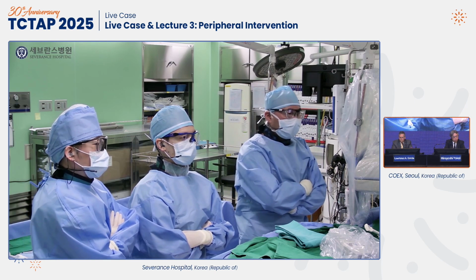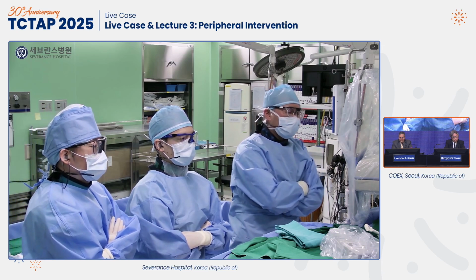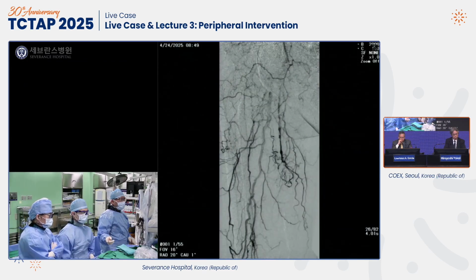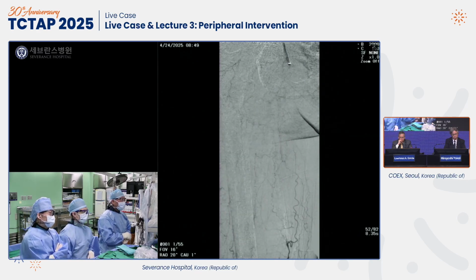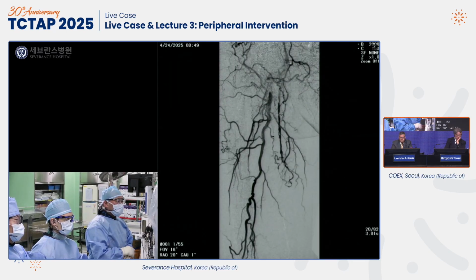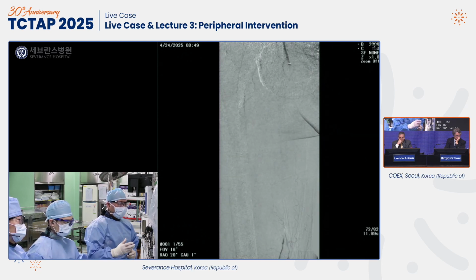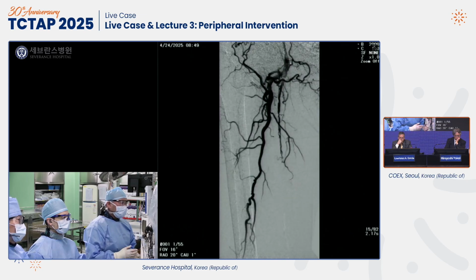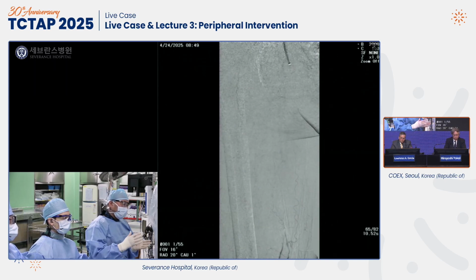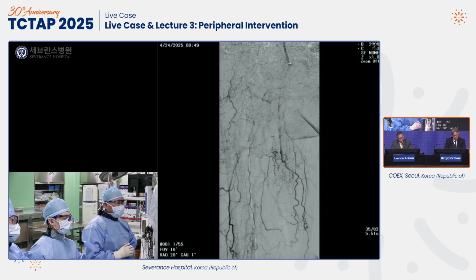But we have the angiogram from last time, and it showed the total occlusion of the mid portion of the SFA, and diffuse stenosis of proximal and distal SFA. So let me show you the baseline angiography. Oh, sorry. Yeah. This is the baseline angiography. This is actually low dose contrast angio. We dilute the contrast up to 10% of the usual dose. And with the software setting, we can visualize the arteries very well. So as you can see, the proximal 1/3 of SFA is visible. It shows diffuse stenosis. And the middle 1/3 is totally occluded. And again, the distal SFA and the popliteal artery are patent, but show diffuse disease.